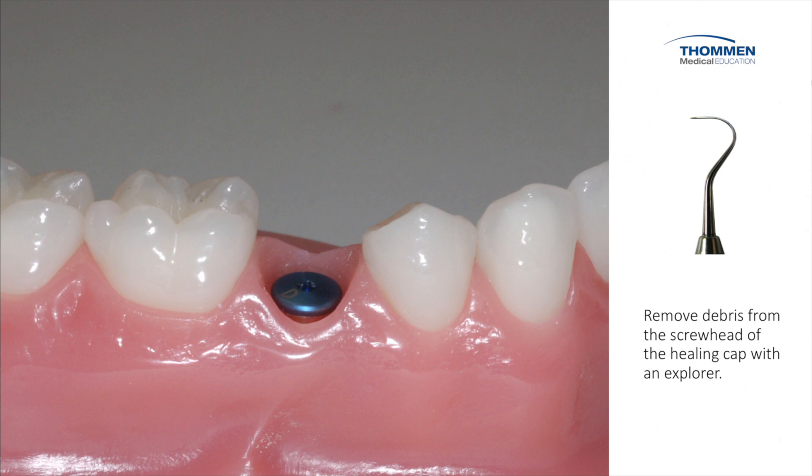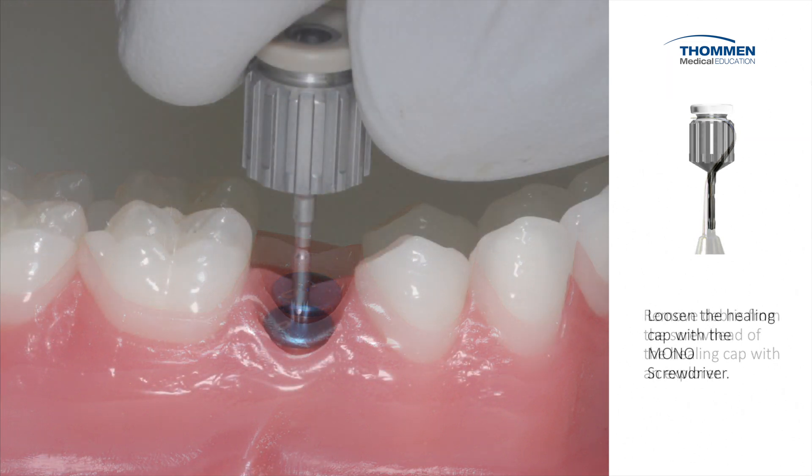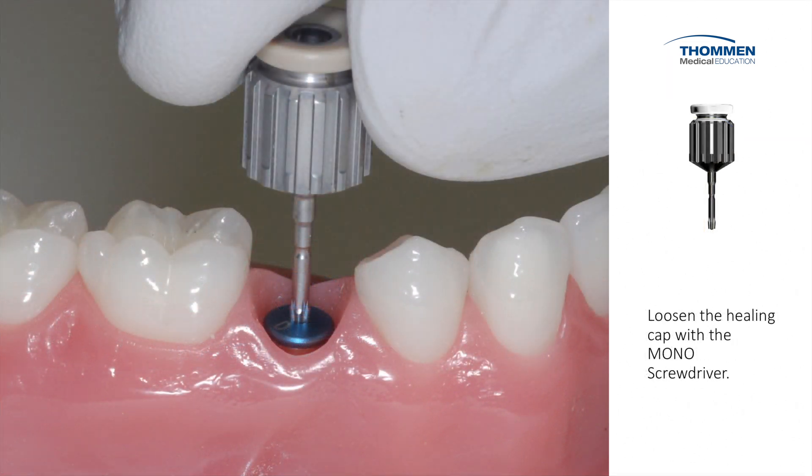We start by removing debris from the screw head of the healing cap or gingiva former. We do this with a sharp explorer. We align the driver with the long axis of the implant and we apply apical pressure as we loosen the gingiva former.